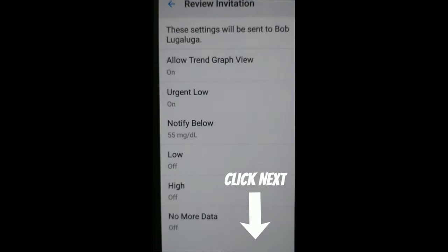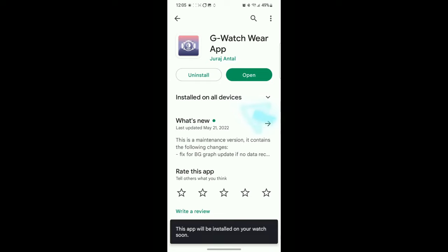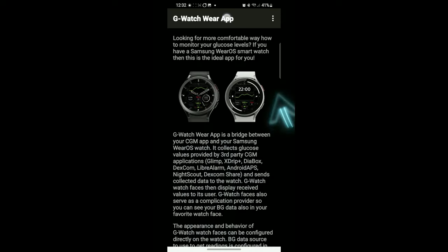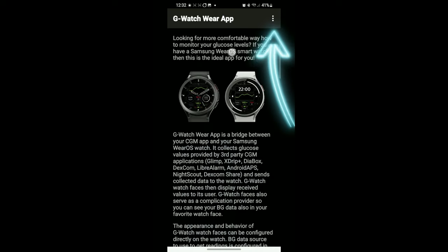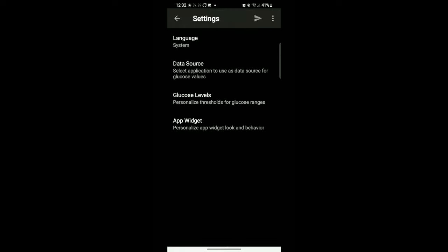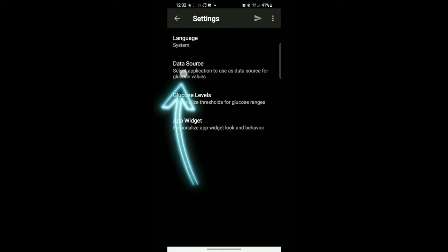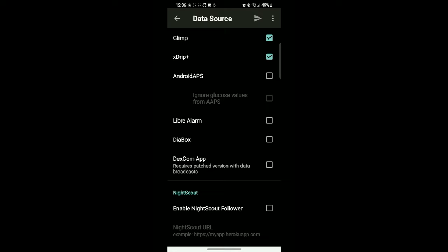Once you're done with that, go to the G Watch Wear app and install that on your phone. That's also in the Android store. Go up to these three dots here, click on settings, and then data sources.